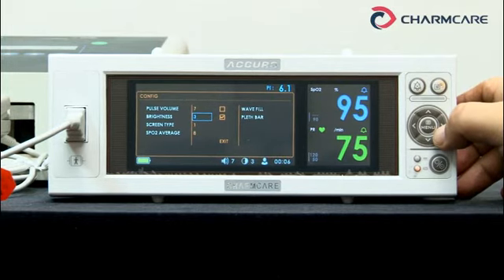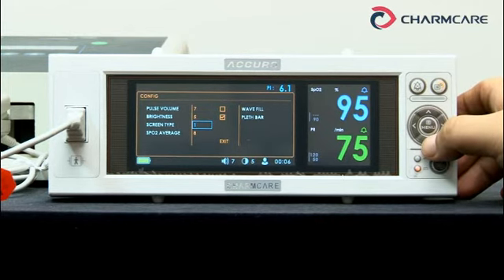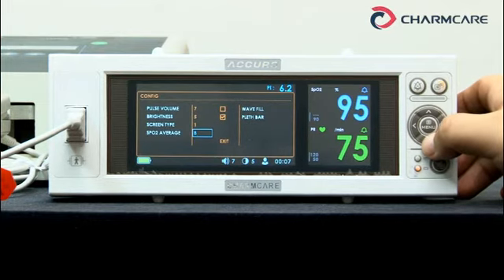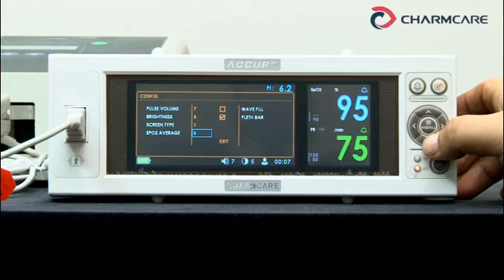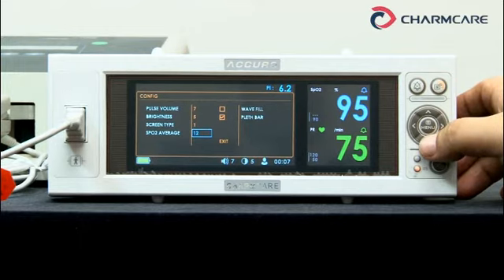Brightness goes from 1 to 5 — it's dark now, medium, and now very bright. Screen time offers 4 screens, as I mentioned before. Now the first screen is set as the main screen. SPO2 average sets the calculation time for SPO2 measurement: 2, 4, 8, or 12 seconds. In case of neonates, 8 or 12 seconds are recommended. Let's set it to 12.